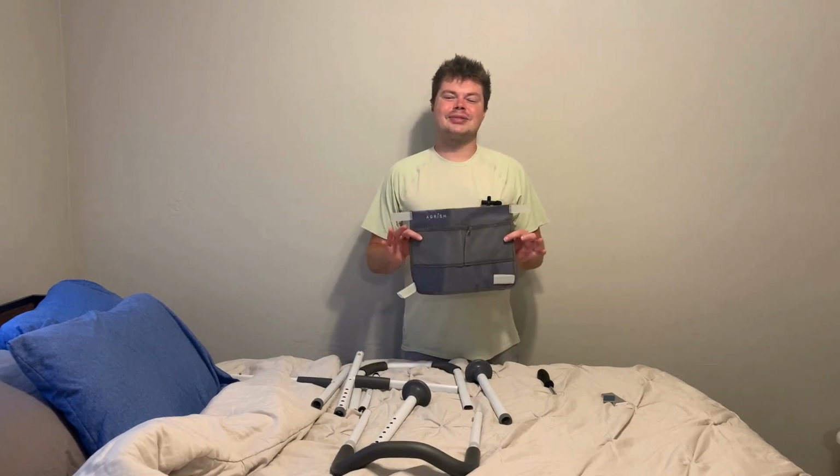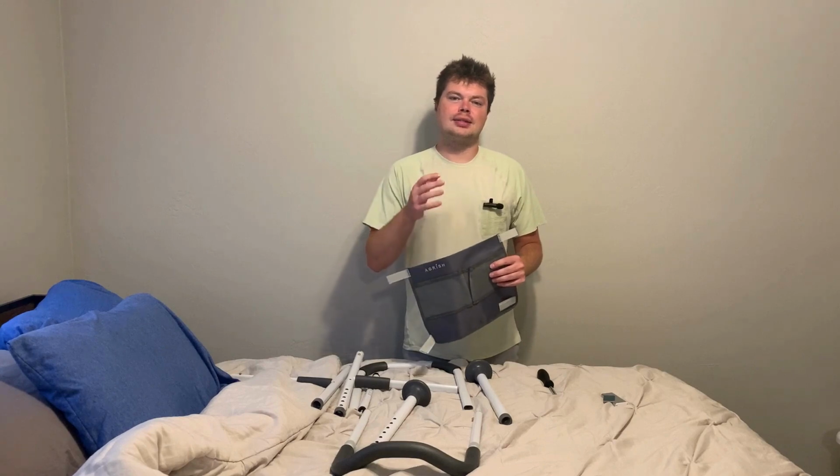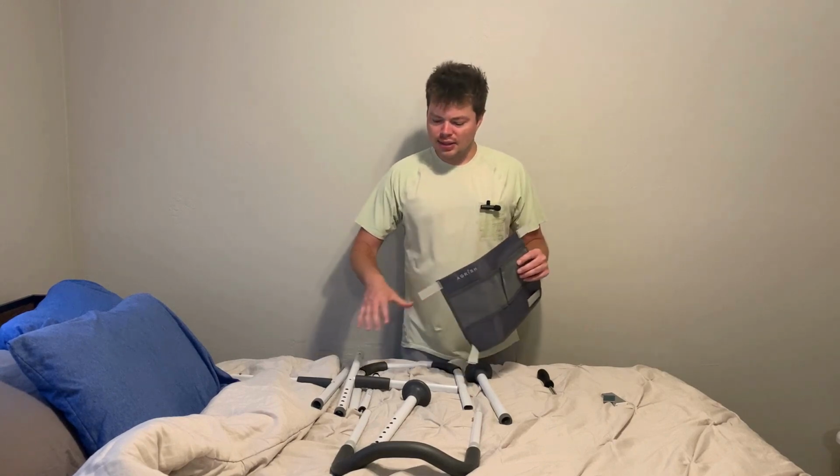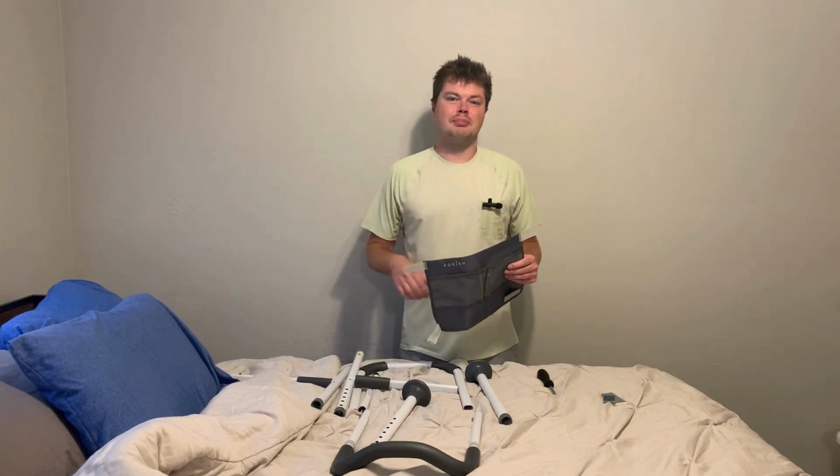So here I have the bed assist rail from Agrish. In this video, I'm going to show you how to assemble your product and then install it onto your bed. These are all the pieces that you get with it. There's really not that many of them. Most of them just pop into place with a simple pin push.